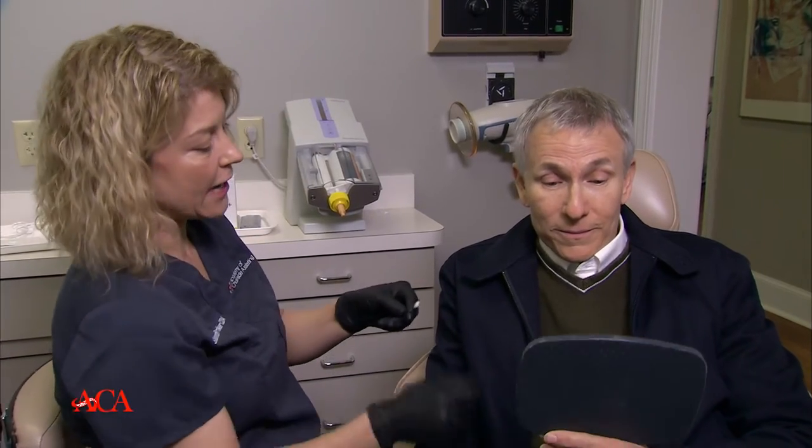Today we're going to be utilizing the Venus White Ultra and we're going to talk with Robert about the shade and what we're hoping to achieve. Most importantly, since Robert has a lower arch that's already been restored, we're trying to get a little bit lighter so his upper teeth can match the lower arch.